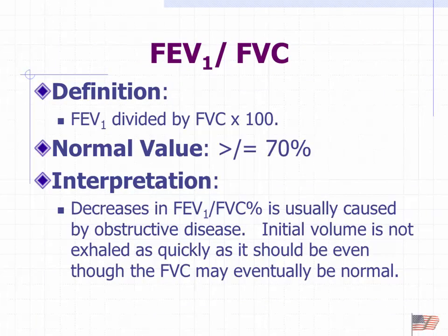as it tells us. And then we compare the ratio, FEV1 to FVC. And that should be greater than or equal to 70%. If it's less than 70%, it's an obstructive defect. And although it may not seem intuitive, the FEV1, a volume, as a ratio compared to the FVC, which is a volume, actually gives us an estimation of flow. What percentage of the total amount that you can exhale forcefully do you do in 1 second?